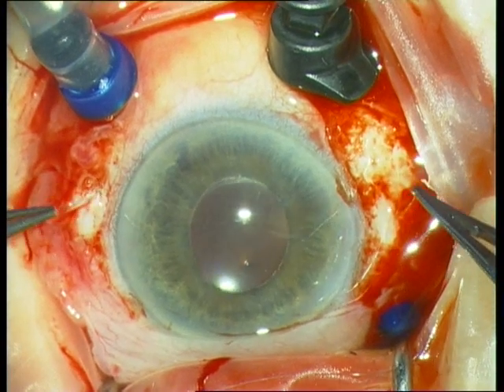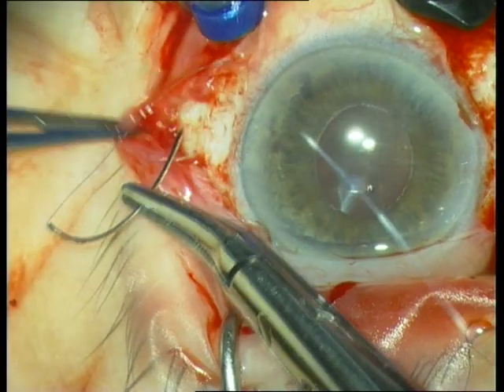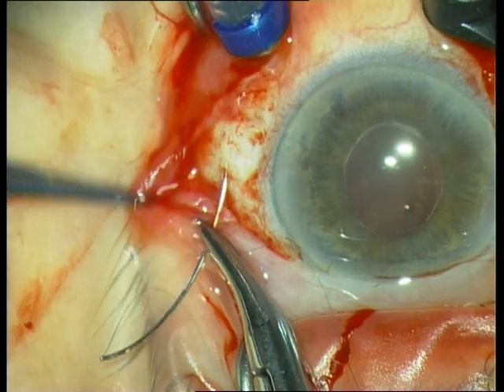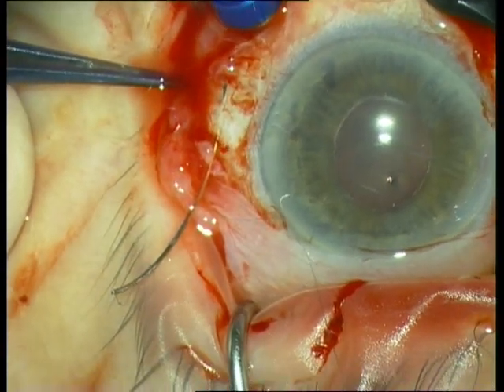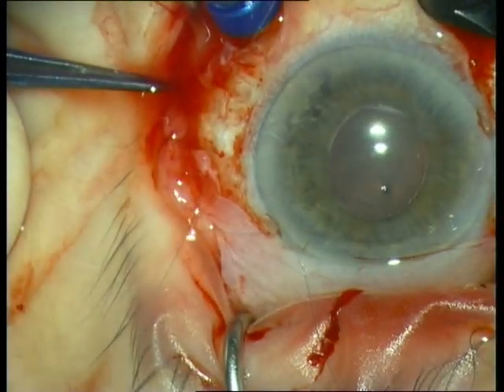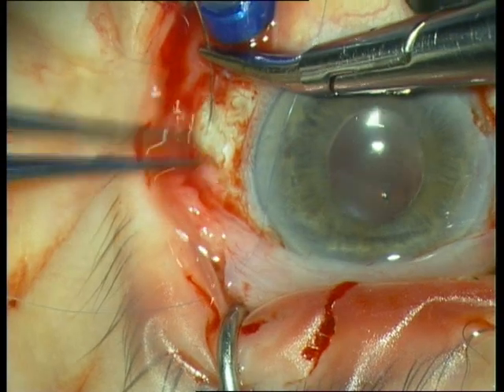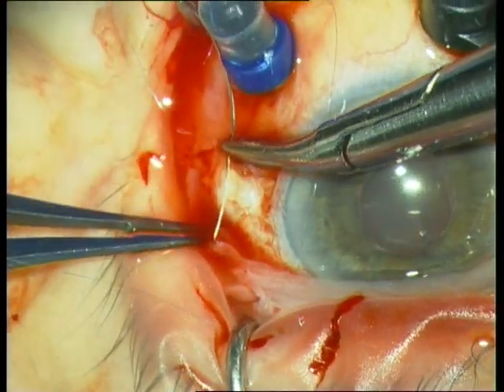Then centrate the IOL by pulling on both sutures carefully. Next we fixate the Prolene 10-0 suture to the sclerotomy by suturing 5 U-turns, or serpentines, into the sclerotomy. Here you see the 5 U-turns, which reduces postoperative discomfort.